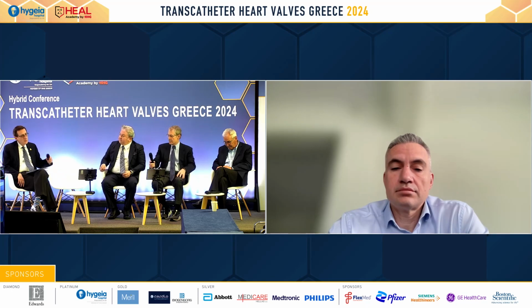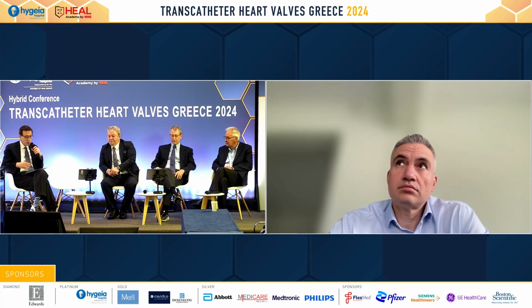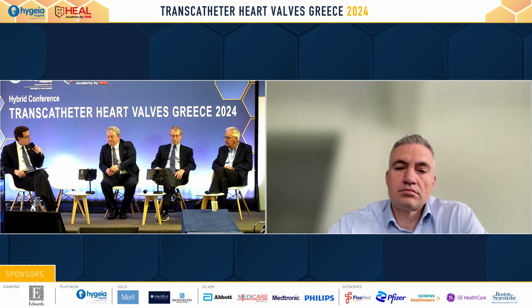So Gilbert's done a lot of work showing us how to do this, and we teach all our fellows on all these self-expanding valves to line up the commissures. Coronary access is becoming a very important factor because we're moving to younger patients. And in the older population, perhaps AS protects in some ways or has protected them from development of CAD, or the disease is not aligned all the time. But the earlier you relieve the aortic stenosis, the more exposed you are to risks of CAD later. So it's an important factor to be considered. Perhaps Dr. Kilic and then Dr. Damascus.